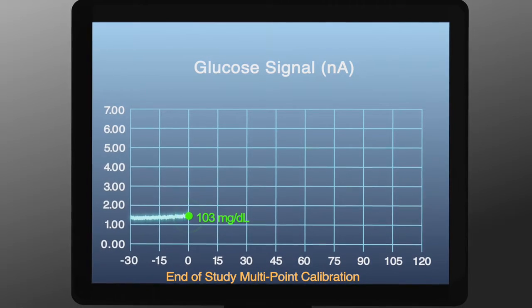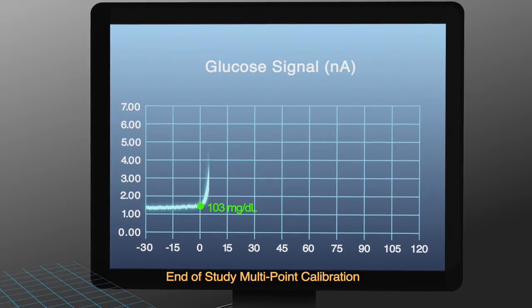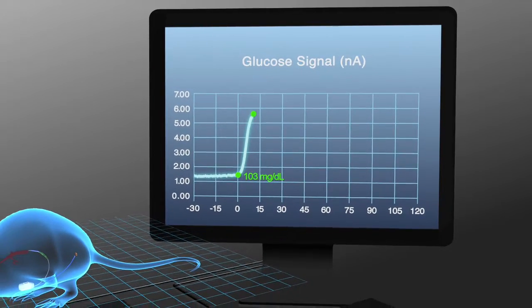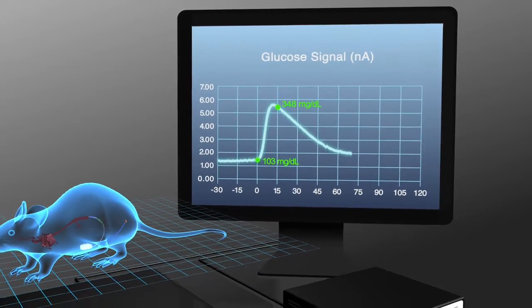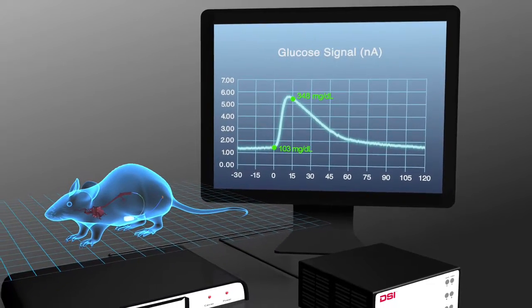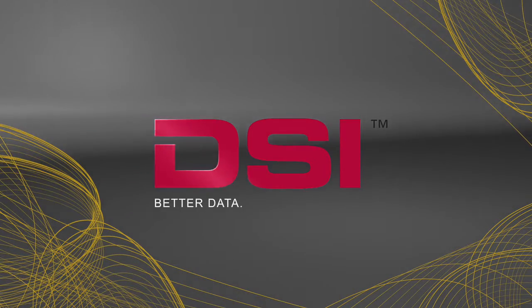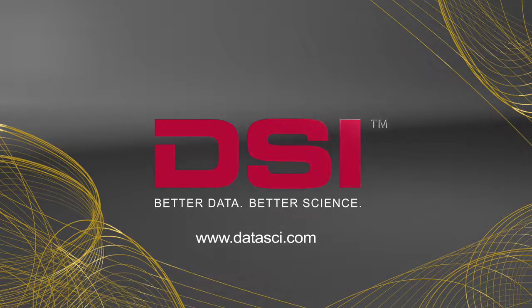Perform an additional multi-point calibration prior to terminating the study to confirm sensor accuracy. Now that you've completed the calibration procedure, you have access to a continuous blood glucose profile from your freely moving research animal. For more information, view the XG calibration tech note on DSI's website.